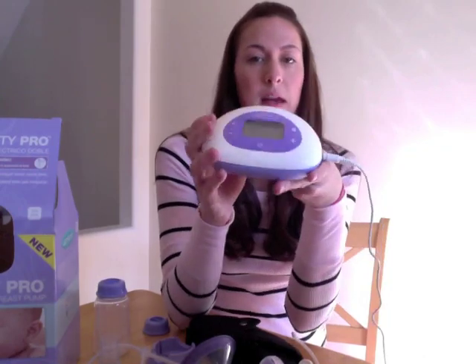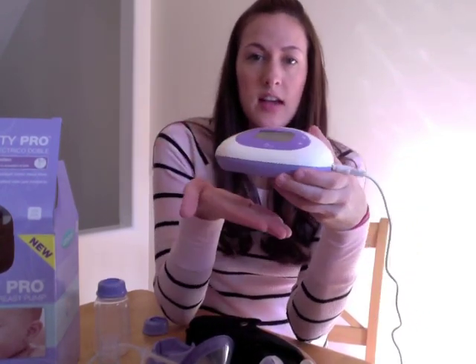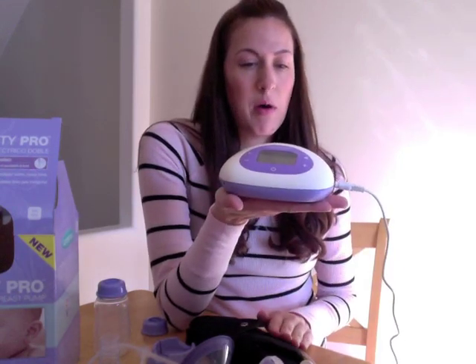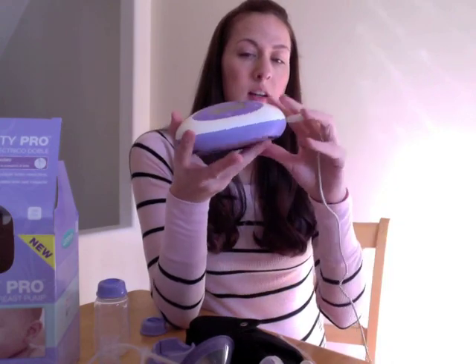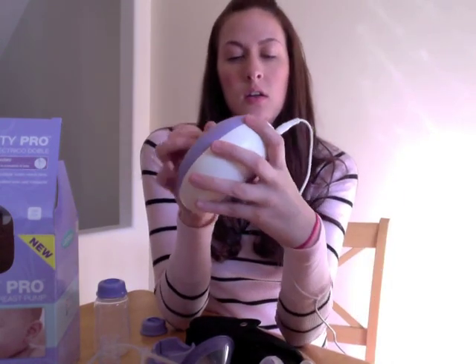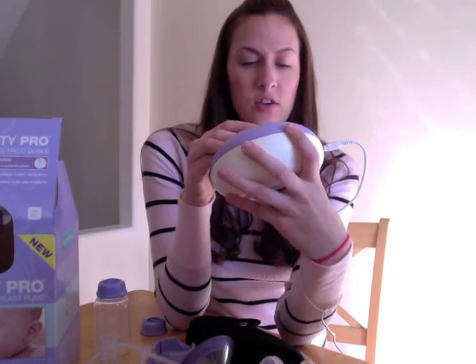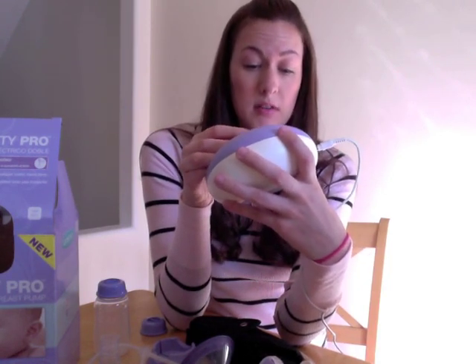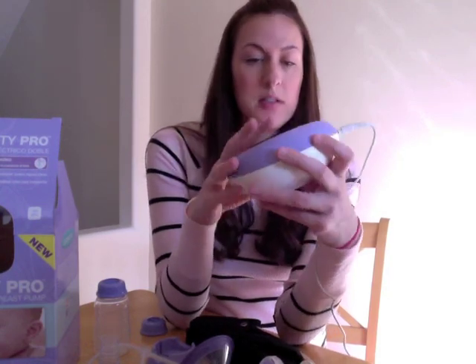This is the base system here, and it's actually very compact. Here's the size of my hand — I can actually hold it in the palm of my hand, so it's pretty small. There's an AC adapter that comes with it, or you can put batteries in here. It takes six AA's. I like that, so just in case you're not near an outlet, you're able to use it battery operated. That's a nice feature to have.